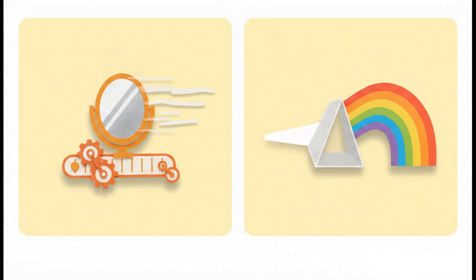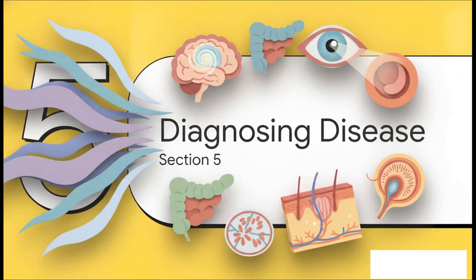Today, though, we use spectral domain OCT. In these modern setups, that reference mirror just stays perfectly still. Instead, the returning, combined light gets separated out by its wavelengths, kind of like shining light through a prism. Then, some absolutely mind-bending complex math reconstructs all that depth information instantly. This lets doctors do much faster, super dense scanning, creating these amazing 3D reconstructions with virtually zero motion blur from the patient. Which brings us to our final section, Section 5, Diagnosing Disease with Light.